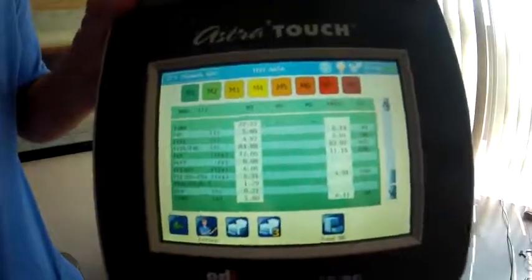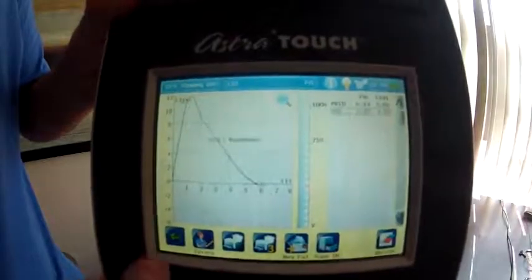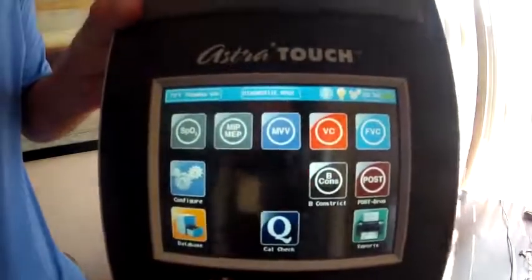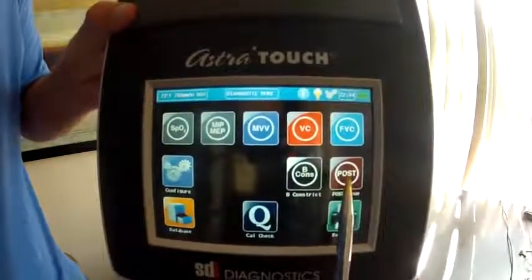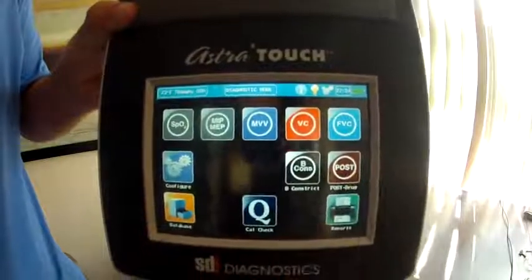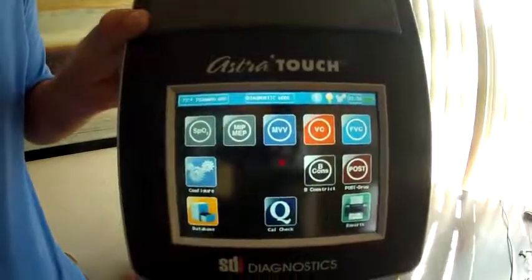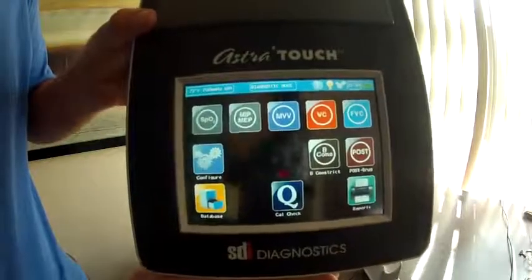That's it. When you're done, you just go back to the screen, see the result again, and go back to the home menu. If you want to do a pre and post bronchodilator challenge, after you've done the first FVC screen you can push the post button to move on to that. I hope that answers all your questions — that's it for my demonstration. Please feel free to contact SDI if you have any more questions.